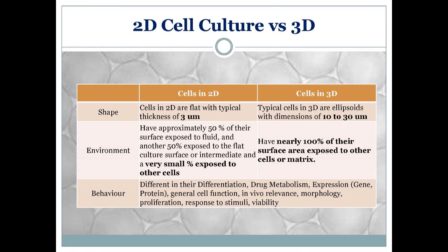In terms of behaviors, cells in 2D are different from cells in 3D in their differentiation, drug metabolism, expression such as gene and protein, general cell functions, in vivo relevance, morphology, proliferation, response to stimuli, and viability.